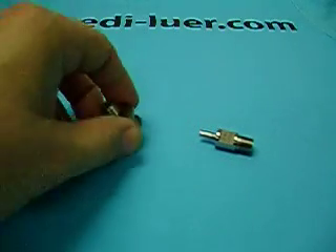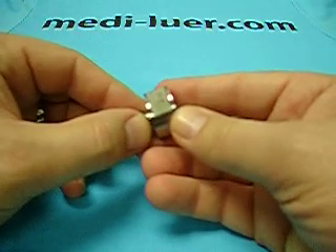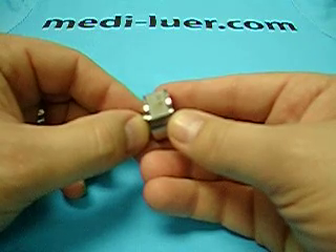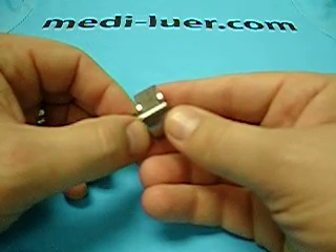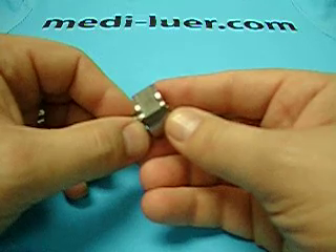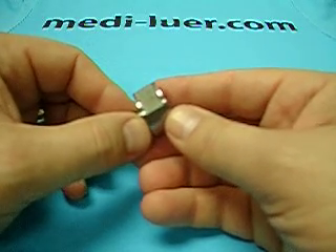What I am going to demonstrate for you is how to use this reference fitting. This is an ISO 594/1 figure four reference fitting. You will notice that I did not call it a gauge. It in itself does not test the part that you are going to measure or test. This just attaches to the part so that the part can be measured.